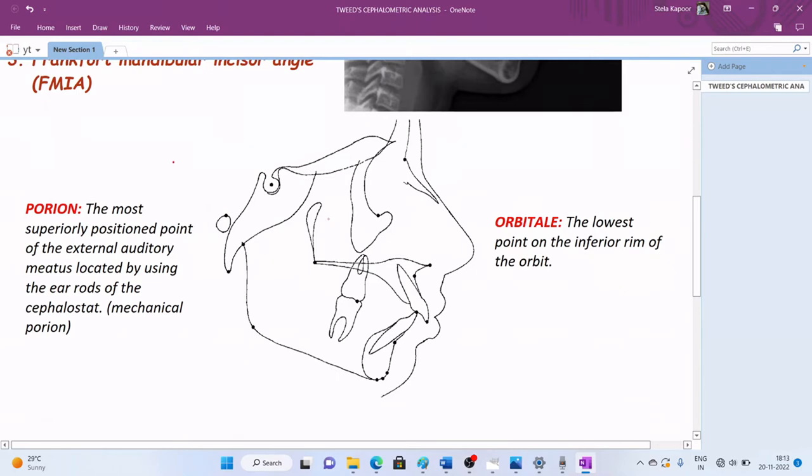Those two points are porion and orbitale. According to Jacobson, porion is the most superiorly positioned point on the external auditory meatus located by using the ear rods of the cephalostat. This is basically the mechanical porion.